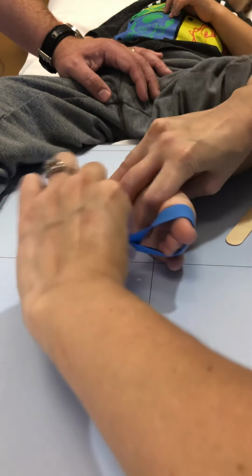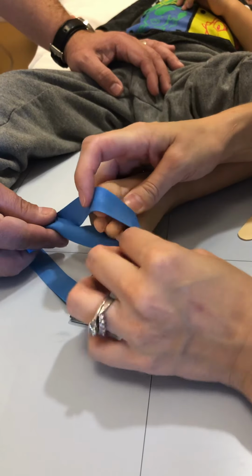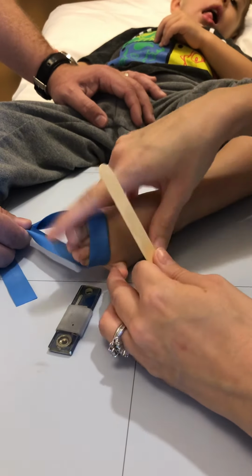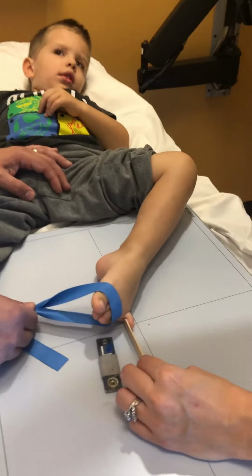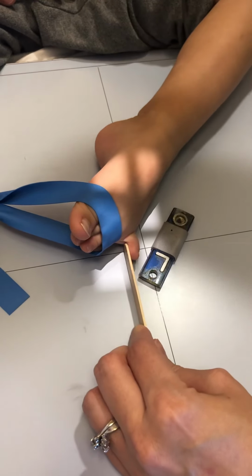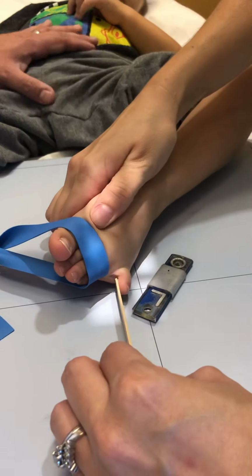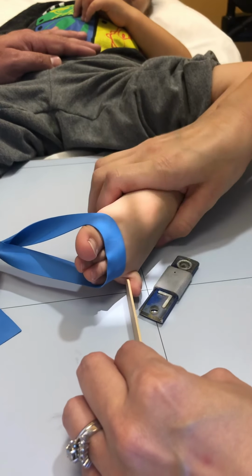So you can have the parent hold the tourniquet if you can get it. Does that tickle? Yeah. And then, so he's holding those toes and I'm holding this toe. And we're going to center on that toe. Put my marker in there, and just like that, we get a lateral toe. Make sure that they're not rotated, you know, medially. Make sure they're nice and lateral to the toe, okay?